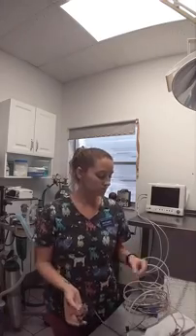So that's when you would probably want to notify the doctor, let them know that it's continuing to drop, and that you've checked the placement and it's not that, so that you can start taking the precautions to start treating the patient. If it's under 85% for longer than 30 seconds, that's when it's considered a medical emergency. So that's when, at this point in time, you've started trying to take the precautions to figure out what's going on and help the patient.